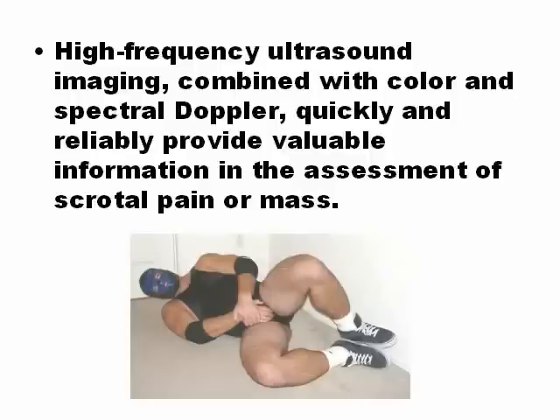High frequency ultrasound is the best for testicles because they are really superficial organs. Unlike the ovaries that are deep in the abdominal cavity, testicles are superficial, and a lot of different diseases can be diagnosed with scrotal ultrasound. Scrotal pain, scrotal mass, trauma, there are a lot of diseases that can be diagnosed with ultrasound.